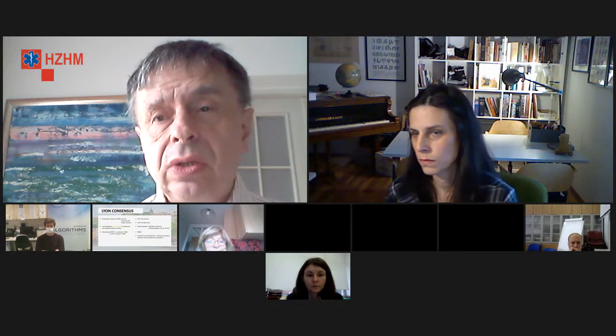To je kod ovih stvari gdje se praktički ne može drugačije odrediti. Idem na vizualizaciju, vidim mjeru koju sam dobio manometrijom i onda to tako određujem. Naravno, kod ostalih metoda koje radim, antroduodenalne i tankocrijevne manometrije ili kolon manometrije, tu uvijek radim uz pomoć endoskopa. To je nemoguće drugačije jer moram klipsati kateter u debelo crijevo ili dolje u tanko crijevo.